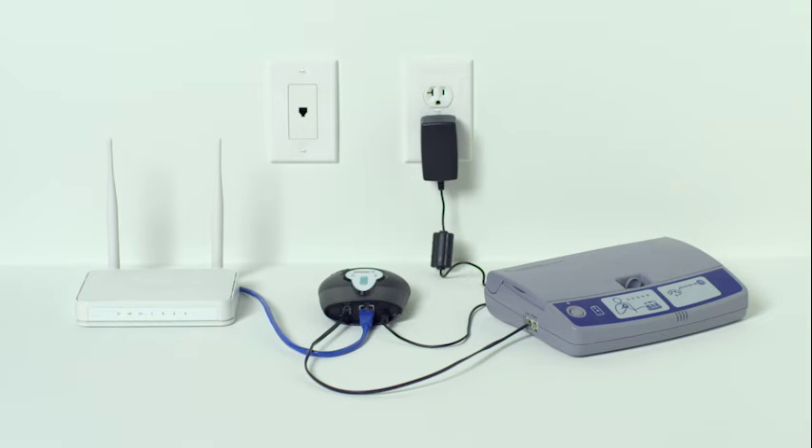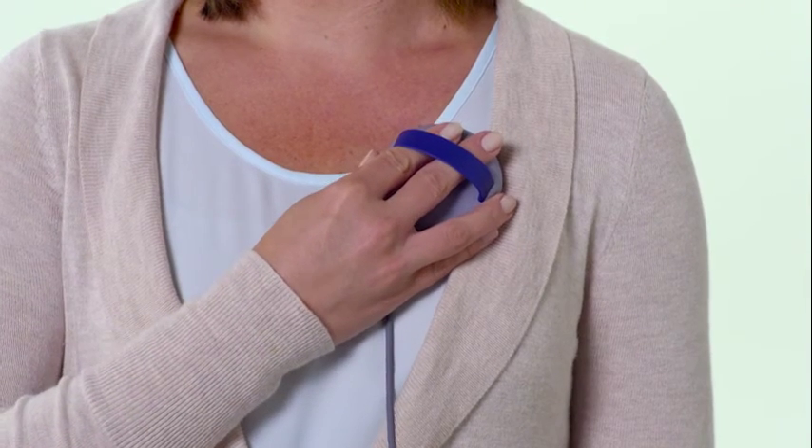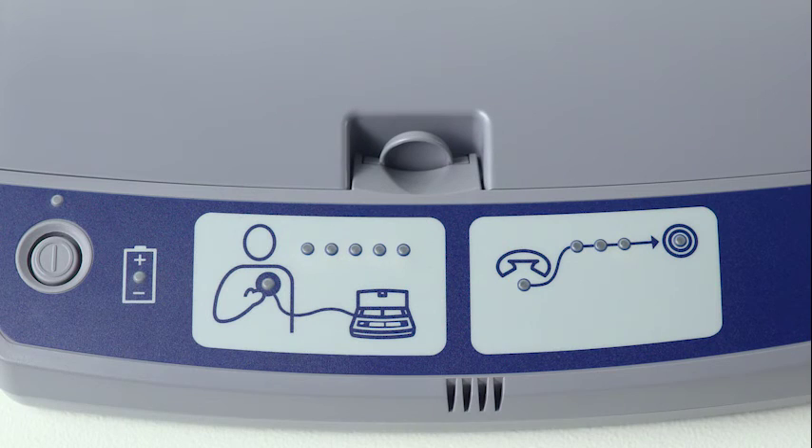With the unit powered, you're now ready to test the new components. The wonderful thing is that once the internet accessory is set up, you will use your existing monitor in exactly the same way you always have. So go ahead and place the antenna over your heart device and press the monitor's button to send heart device information to your clinic.